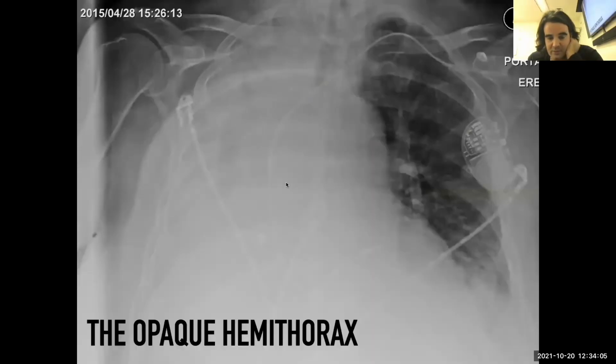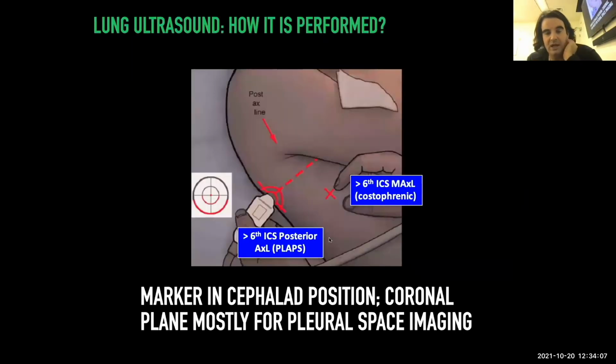So here's, again, a typical coronal plane with the probe marker that's pointed cephalad. So the machine itself should be on, say, abdominal setting, usually not a cardiac setting. The depth usually around 18 to 20 centimeters, but usually I just suggest that people put the actual spine in the far field. That way it maximizes your visualization of the pleural space.